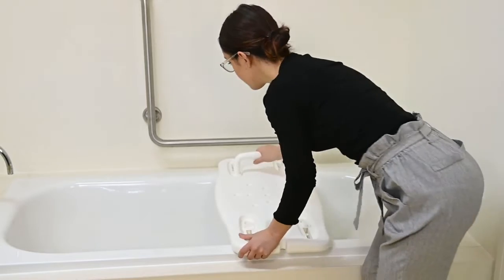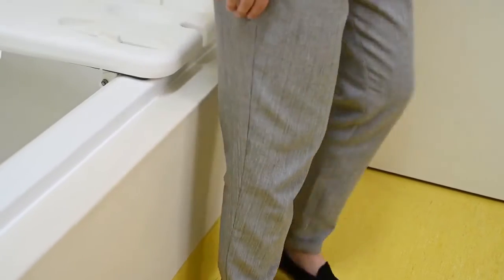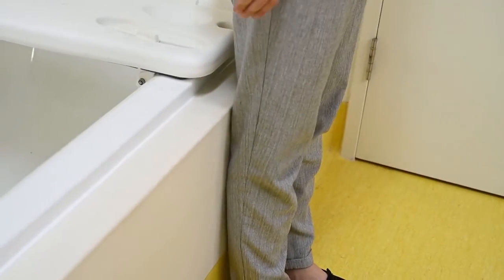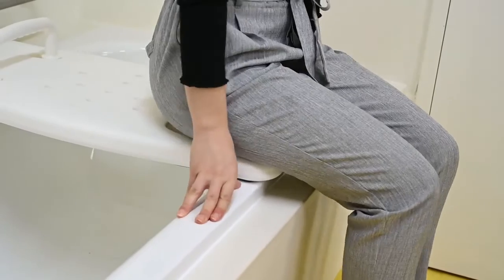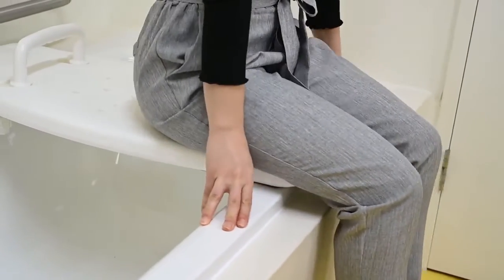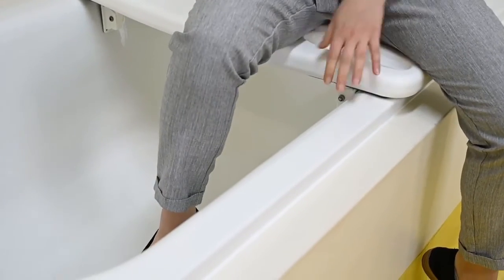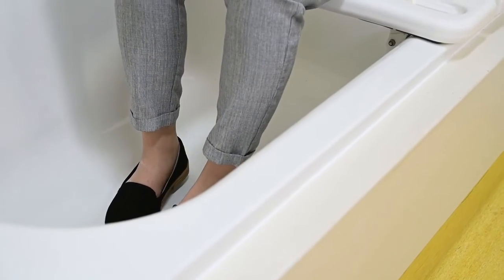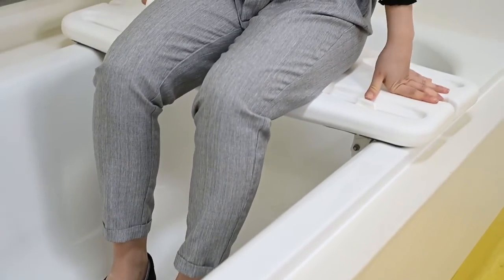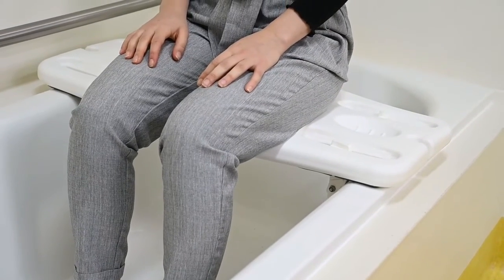To sit, check the bathboard remains secure before each use. Stand with the back of your knees against the side of the bath. Sit down using your hands to steady yourself. Wriggle your bottom backwards towards the centre of the board. Swing your closest leg over the bath edge using the board handle for support, then repeat with the other leg. Adjust your position to ensure your bottom is centred on the board and your feet touch the base of the bath.